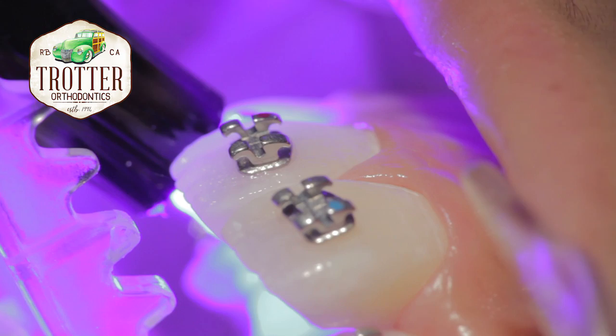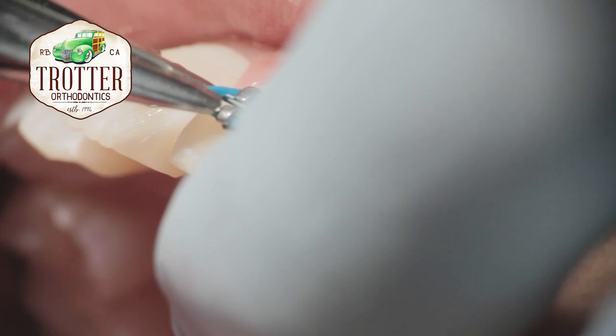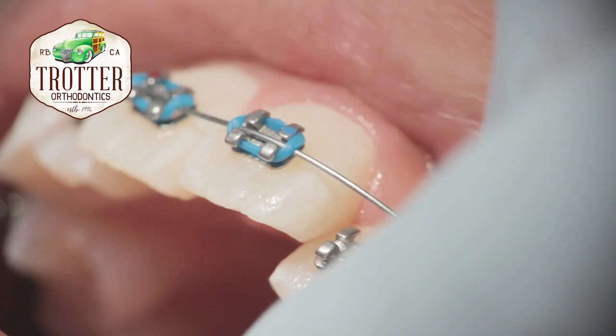The initial wire is placed into the brackets. These wires are attached to the brackets usually with the use of elastic O-rings or thin wire. Once the wire is placed, it begins its process of straightening, thereby moving the teeth into their proper position.